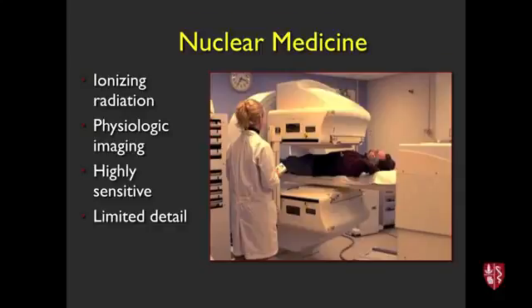And so this patient's having a bone scan, and the technologist is standing here. And so, it's safe to be within distance of this patient here. So he's, quote, radioactive, like glowing in the dark. It's not that bad, right? So it's not insignificant, but it's not enough to worry about neighboring techs, for example.